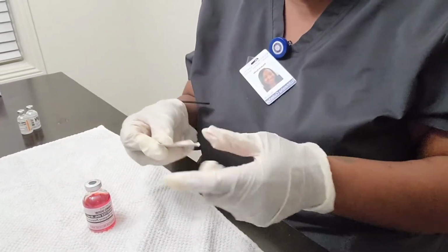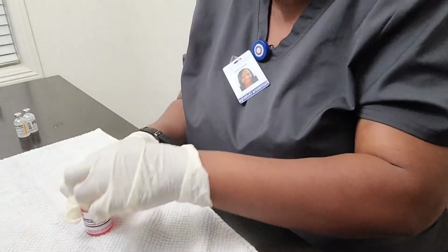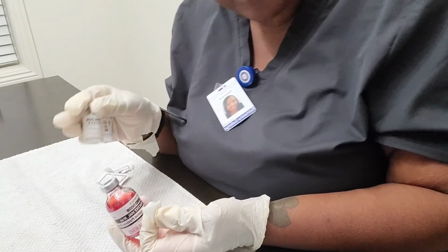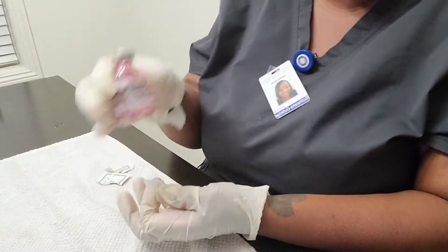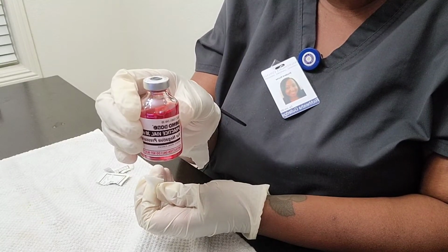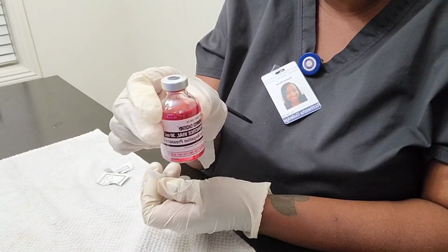Okay, so I have an alcohol wipe, and I will go ahead with the alcohol pad wipe. I only received these three items in my kit. This is insulin, which I will not be using, and then I received this. It's the only other medicine, so I will be using this as my medication.